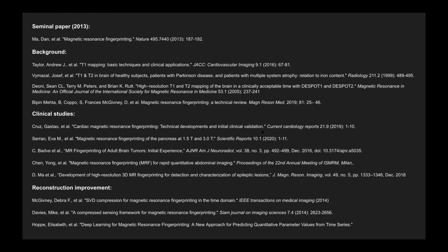So you can account for B0 inhomogeneity through off resonance, like we saw in the Bloch simulator. As for B1, I'm not sure exactly how you would do it with the code we've seen in class, but I would imagine, like Mickey said, it changes the flip angle. So you could account for that by having another parameter, which is, at each pixel, you have some B1 error, and that increases or decreases your flip angle from what it should be at that pixel. So that's a way that you could account for it and include it as a parameter.